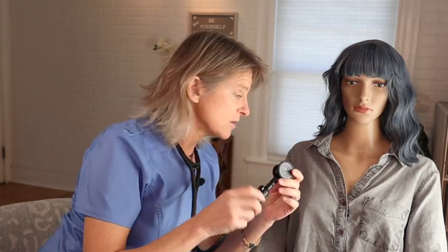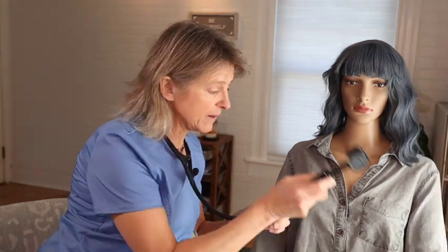So I need to turn my stethoscope. I'm not going to expose Jade's chest because I don't think that would be appropriate on camera. But I am going to go down to the apex area. That's where the mitral valve is. And that one is a lower frequency sound. That's why I use the bell in that area.